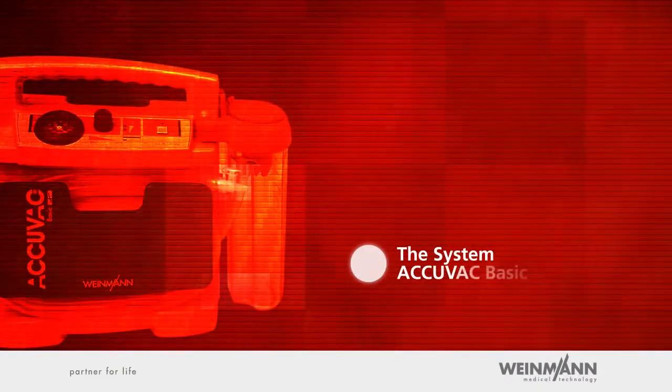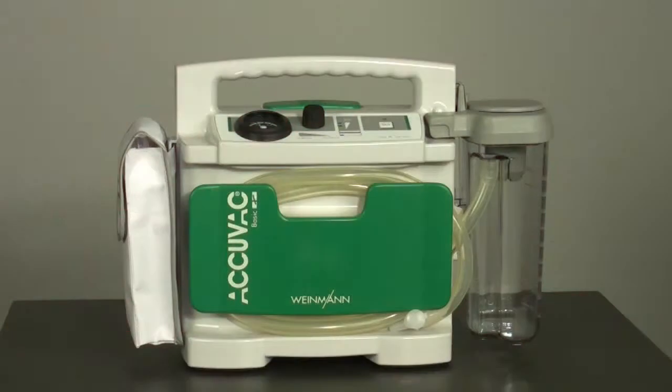The system ACUVAC BASIC consists of the following components: one, motor unit including handle, tube holder plate and operating panel; two, collection canister including tubing, shown here as a reusable component; and three, the accessories bag.